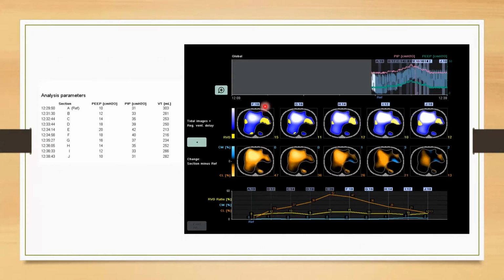And that's the issue also with some of the doctors that want to use the ARDSnet, where there's a PEEP adjustment based on FiO2, which is really not individualized to the patient. So this patient had higher FiO2s, if we would have tried to just place the PEEP based on FiO2, we would have done considerable harm probably here. So you see that the loss of compliance is all throughout the lung. So the best PEEP actually is 10.